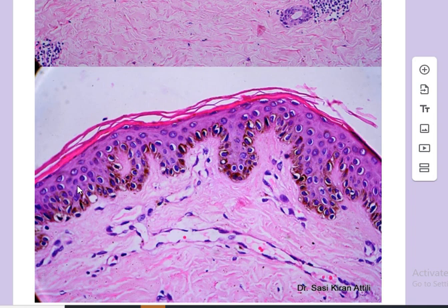Almost all the keratinocytes within the epidermis look similar. They have these changes in the superficial and in the basal layer. So remember, you don't find melanocytes this high up in the epidermis unless it's a melanoma, of course. So these are not melanocytes. This is a melanocyte here, a spindle-shaped cell with a perinuclear halo. But the remaining ones, this is a melanocyte probably. This is probably part of a melanocyte. This is a melanocyte. The approximate melanocyte to keratinocyte ratio is around 1:8 in the epidermis. So these are not all melanocytes. These are all just simply keratinocytes with a perinuclear halo.